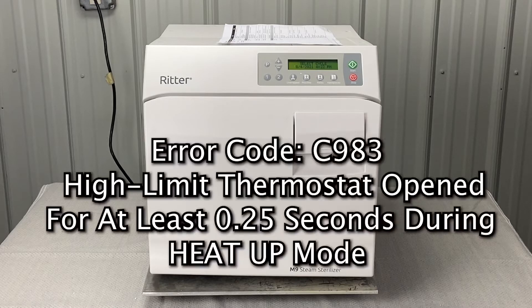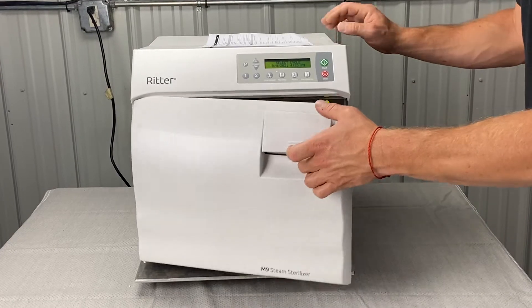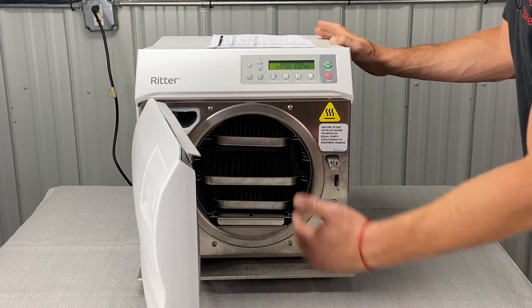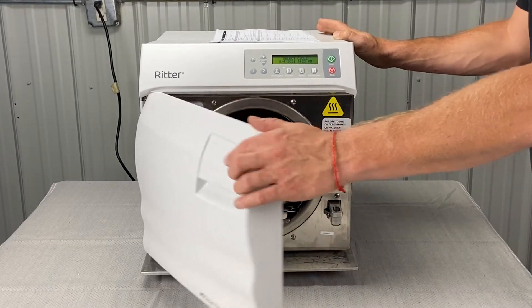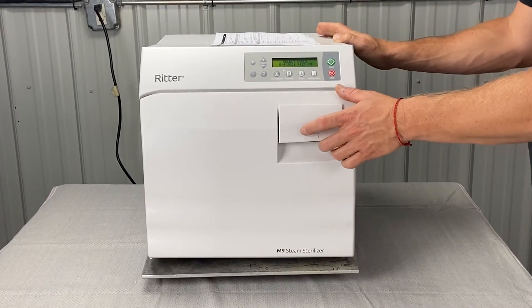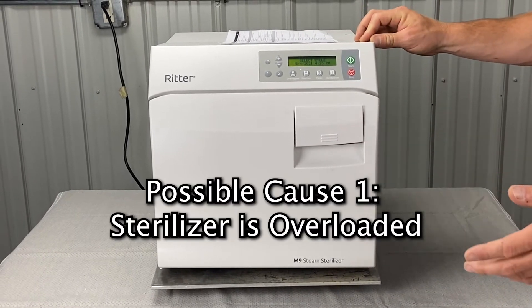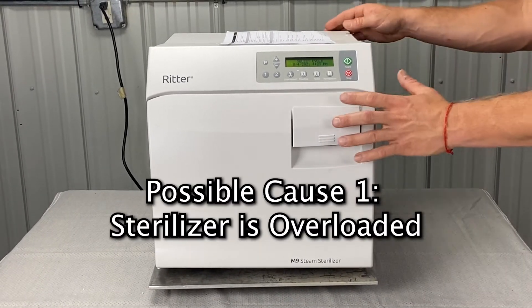We're going to talk about the Charlie 983 error code. The first thing we're going to do is let the unit cool down, open it up, pull all the instruments out, all the trays out — everything's coming out — and we're going to run an empty cycle. One of the first causes on this list is that the sterilizer is overloaded, so let's rule that out completely.